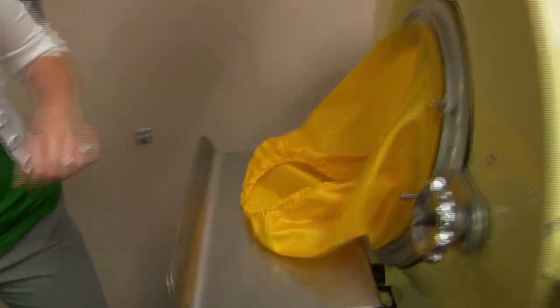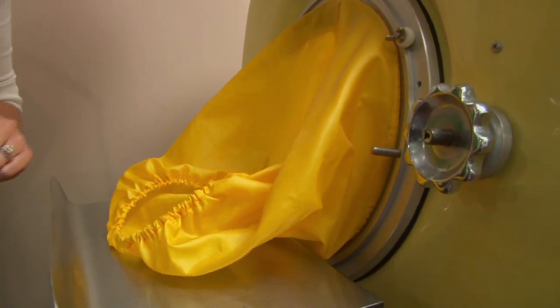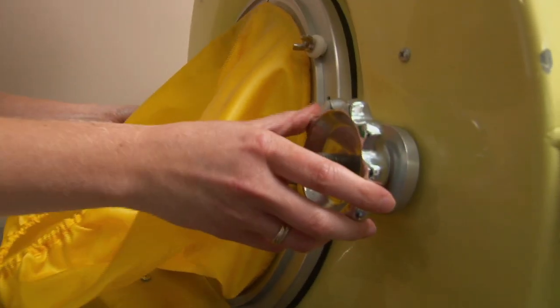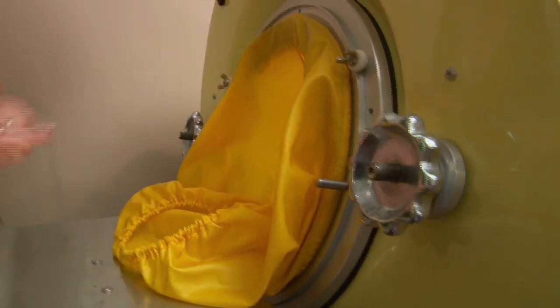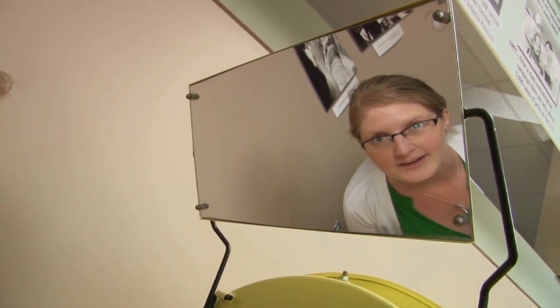At the head of the machine is the collar that fits snugly around the patient's neck. This would have been made out of a sponge material or a plastic. There are also knobs to adjust the bed position inside, and a mirror so the patient can see what's going on in the world around them. This could also be a book rest, although somebody else would have to turn the pages.